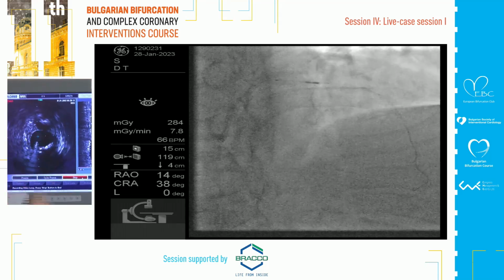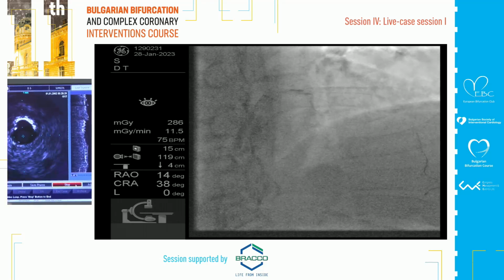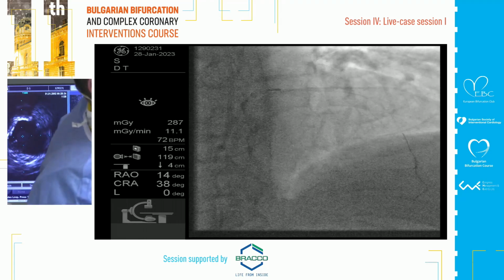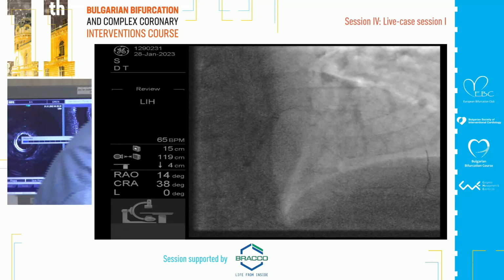And that's a septal, which is diseased, interesting. And that's a good landing zone, and actually soft. Okay, I see. This plaque looks the same, proximal to the calcium lesion. Was it polished, more? And this is the left main, and there is a very short part of the calcium ring.